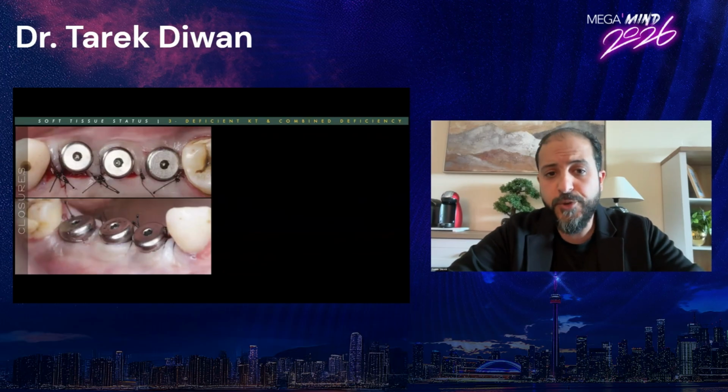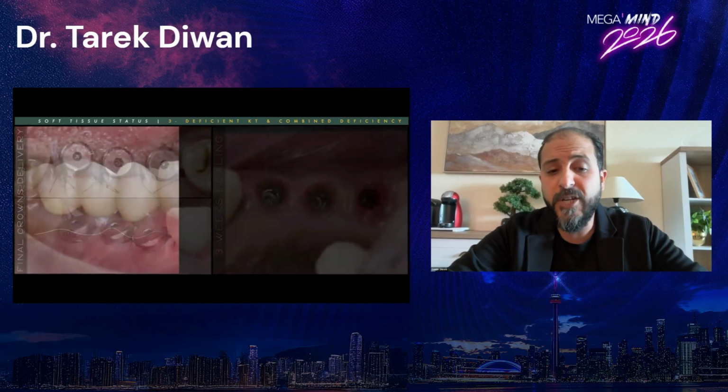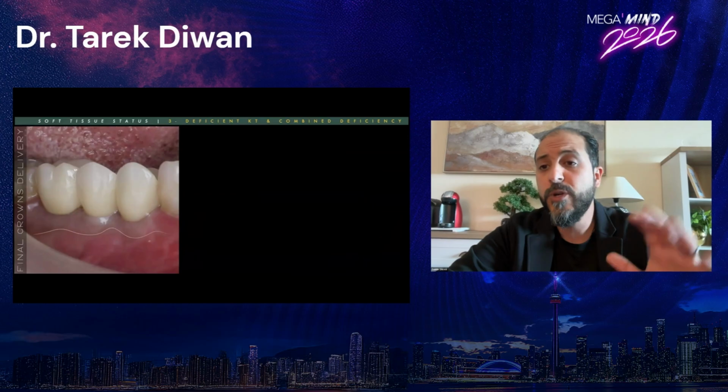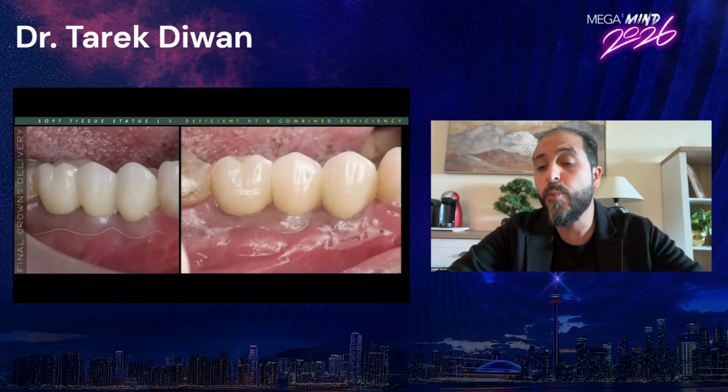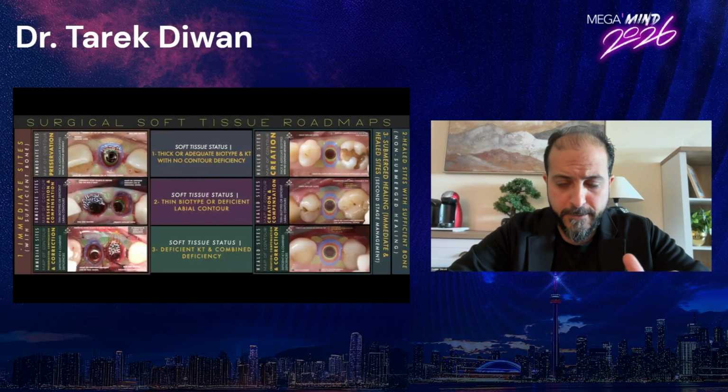We secured the papillae back with sutures, and from there, in 3 weeks' time, it's ready for the final shaping of the final tissue, scanning, and doing the final crowns without any loss of the papillae. And that is why we say always frame it with the optimized pink.